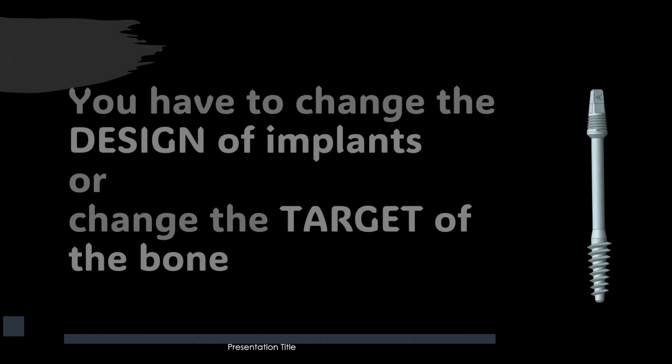Whereas if we change the design, we not only prevent ourselves from giving extra surgical procedures to the patient, such as bone grafting, ridge splitting or sinus lifting procedures, but we can also manage all those patients who have narrow ridges, who have compromised bone, who have medical conditions such as diabetes or other medical conditions.